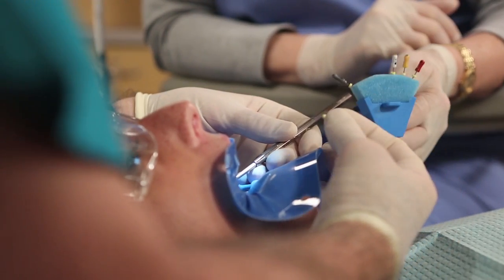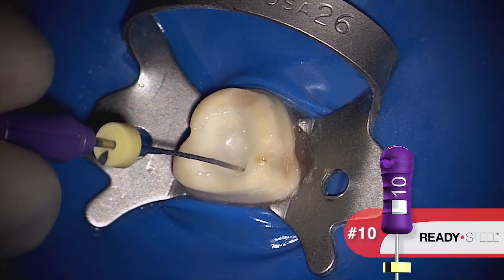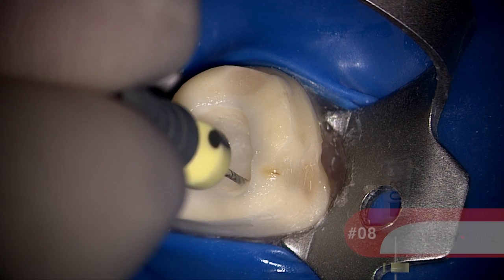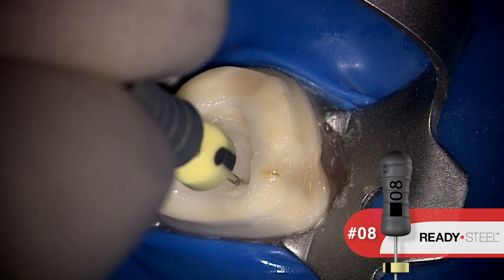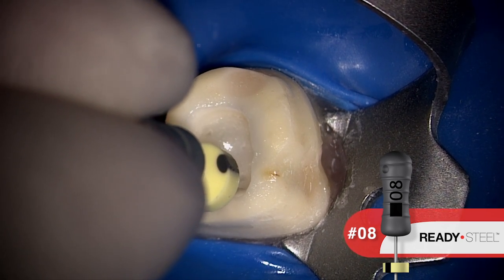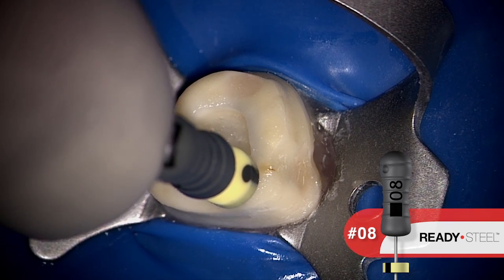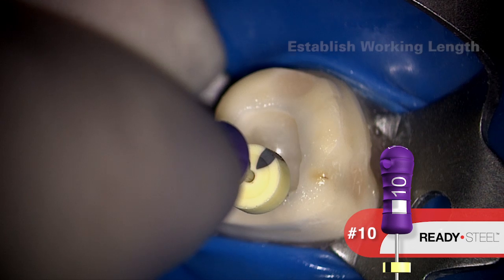Let's talk just a little bit about glide path management. It's really important to secure canals and have a smooth, reproducible glide path before we ever entertain shaping canals with rotary files. In this instance, if the canals are longer, more narrow, and curved or recurved, we might need to drop to an 08 file to reach length. Once this instrument has achieved length, the canal is still pretty small in diameter, so it's oftentimes wise to transition from the 08 to the size 10 file.